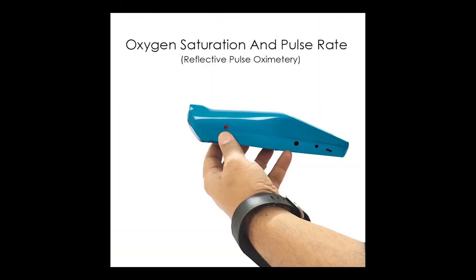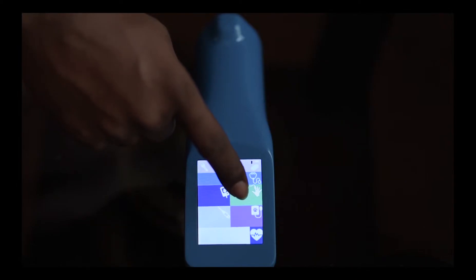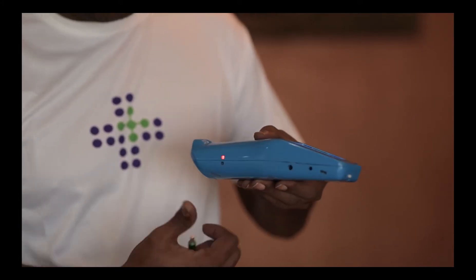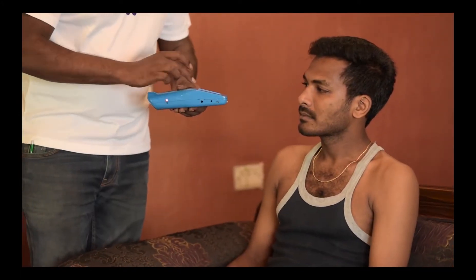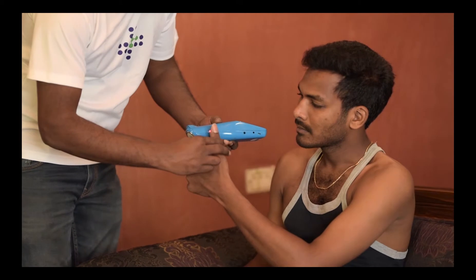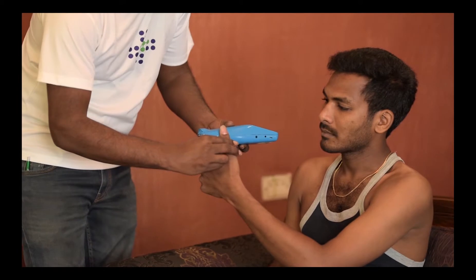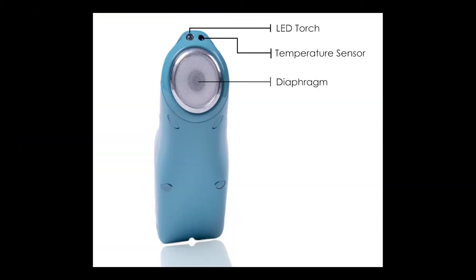We are now going to be measuring the oxygen saturation and pulse rate. The icon is as shown on the device. Once we want to measure this parameter, we touch the touch screen and you see the red LED glowing. The thumb is to be lightly placed in the groove to measure the pulse and oxygen saturation. Once measured, it is displayed on the screen.